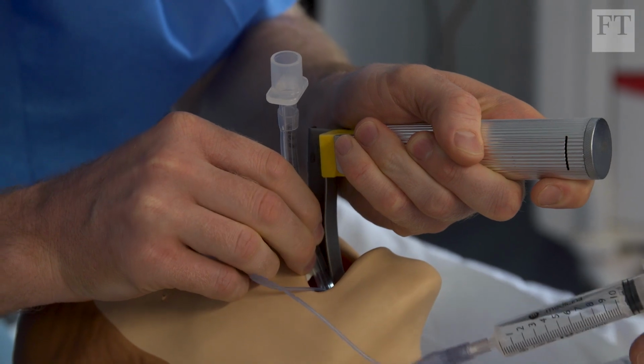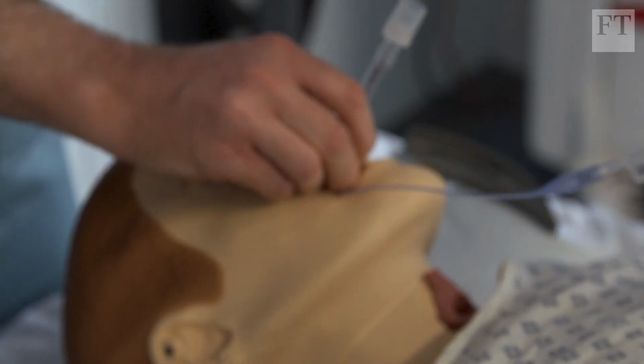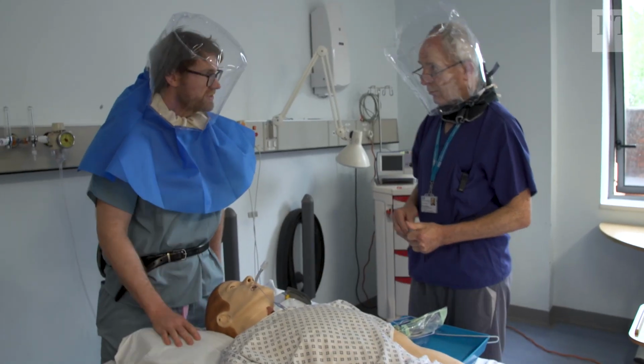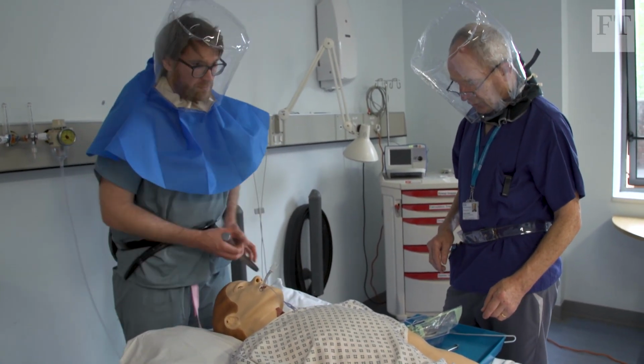And then that goes into the windpipe. We blow the cuff up on the tube and take the scope out, and then we will be able to start the ventilator. Unobstructed view, very easy. Yeah, good. Isn't it? Great.